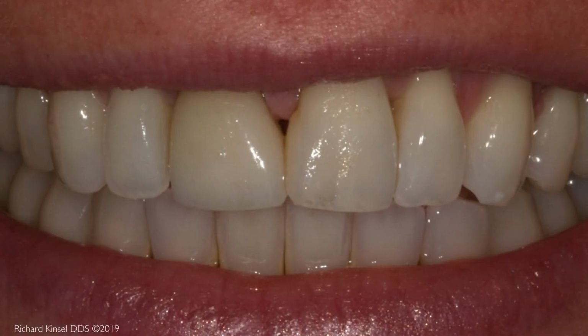This patient requires the replacement of the crown on the left and the composite filling on the right. She was also troubled by the appearance of the dark triangle whenever she smiled. An aesthetic result is also complicated by the differences in width. The proper tooth dimensions must be addressed prior to the final crown and partial veneer.